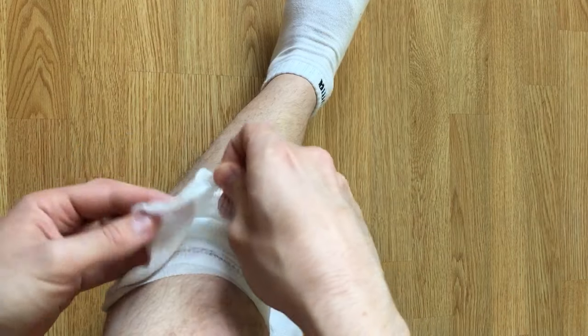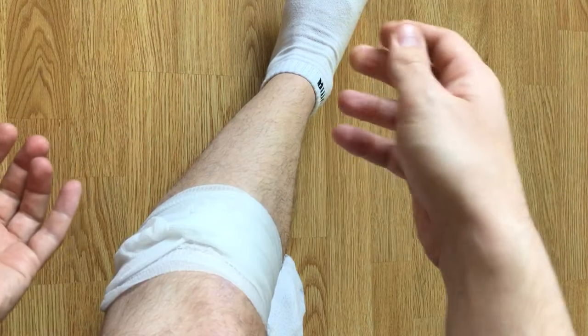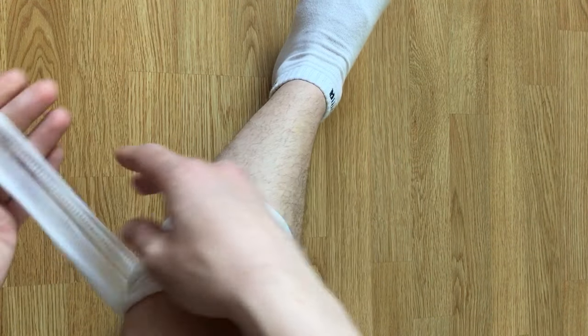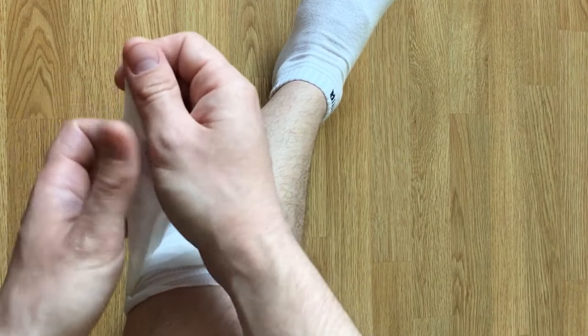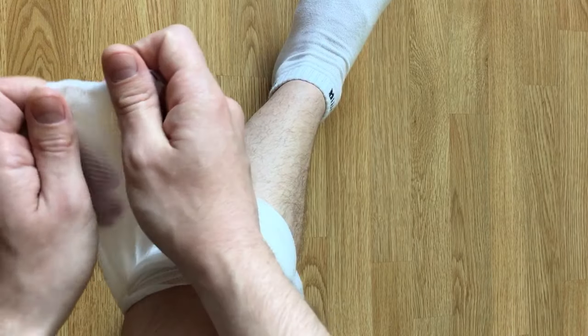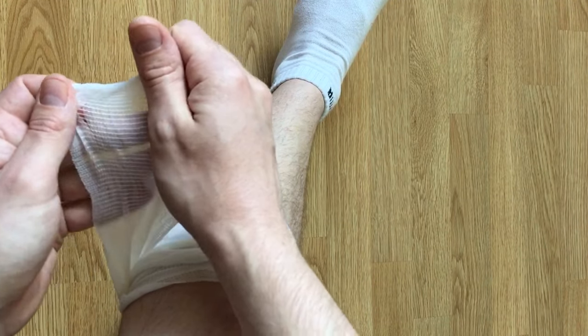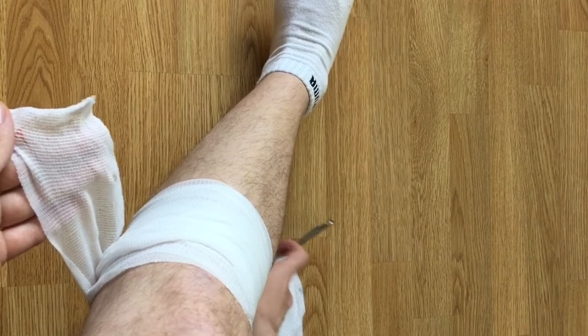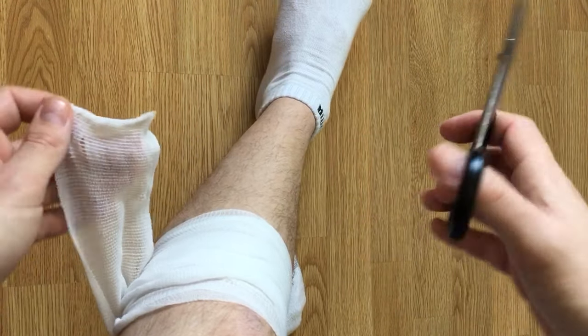Okay, so here we come to the end. Of course you can just tuck it — if you have elastic gauze you can tuck it, which works quite well. But if you have non-elastic gauze, or you're using a cravat or an older type of gauze bandage, you will not have the elasticity. So what do you do? Well, you can tape it in place, or you can simply do what they always did before.